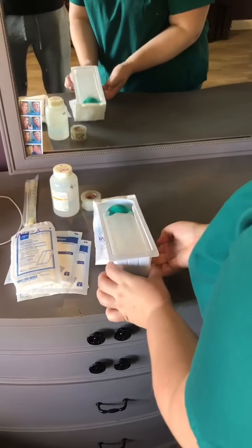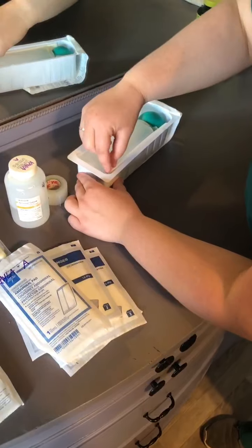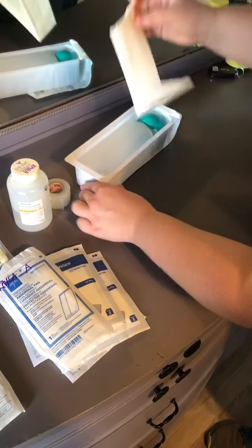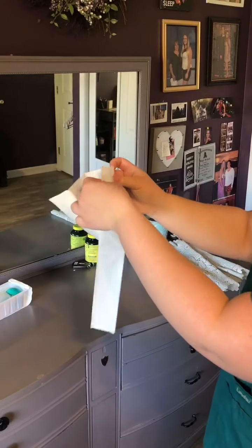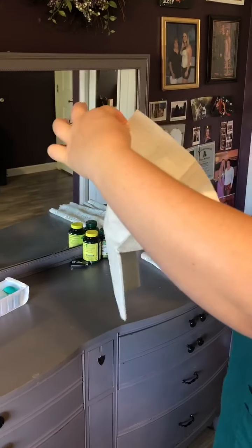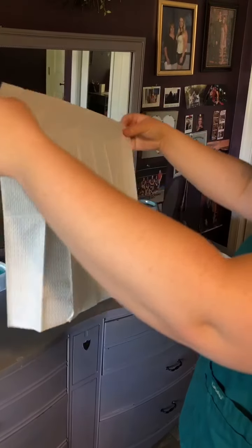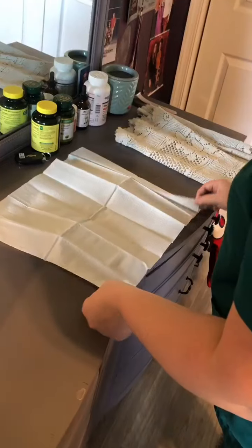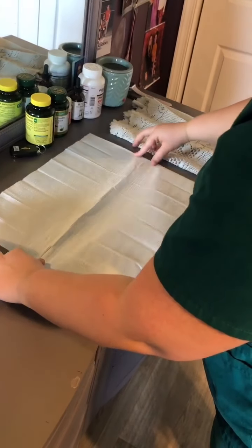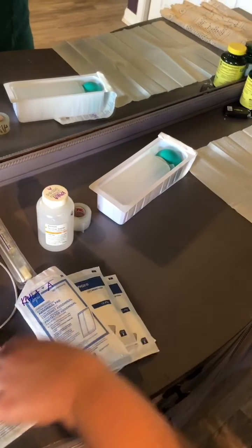Pull that back. So my table is clean, dry, and waist high. And I'm just going to get the drape out. Touch myself. Just touching the outer 1-inch border. So now I'm going to set everything up on there.